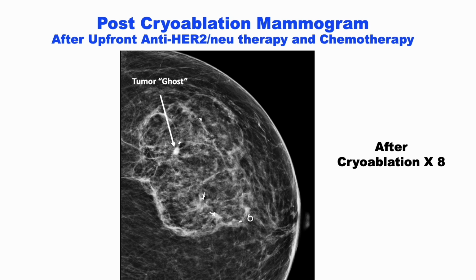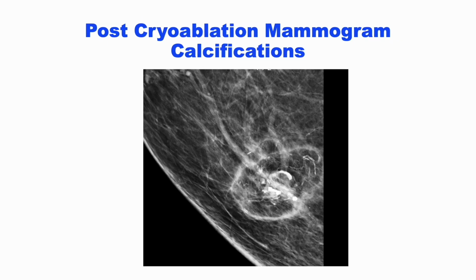You can kind of see these overlapping concentric areas, and again, that was the ghost tumor that persisted post-cryoablation but was also present pre-cryoablation. Although the tumor ghost is expected to gradually disappear, microcalcifications associated with the malignancy are expected to remain in place even when the surrounding cancer cells have been completely killed. In essence, microcalcifications are fossils of dead cancer cells that have become calcified and stone-like, and as such are not digestible by the immune cells, but also not capable of growing.